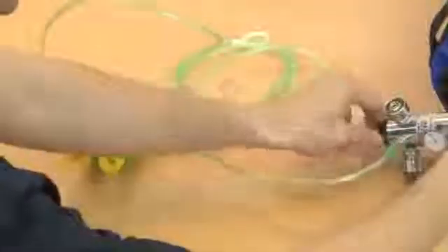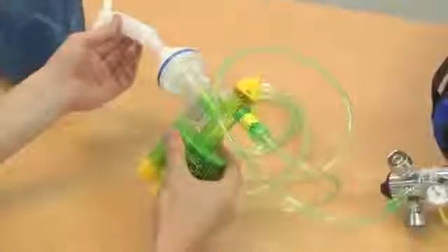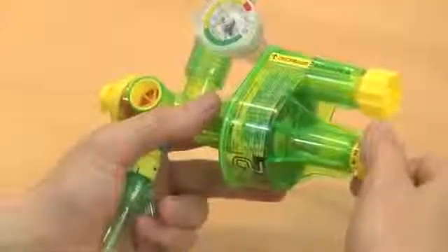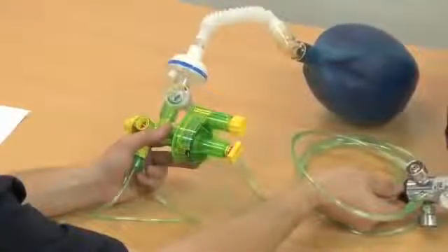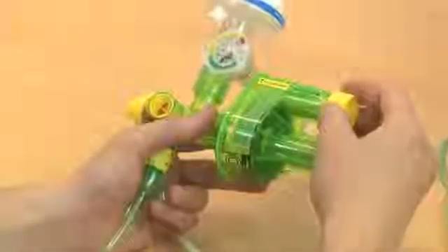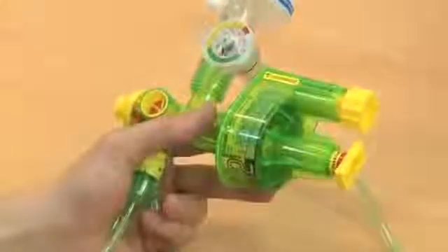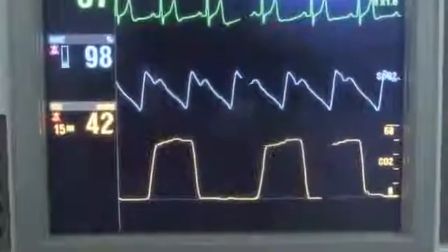Cut the cable tie and assemble the device. Connect to oxygen running at 15 litres per minute. Connect to the patient circuit. Adjust FiO2 by turning the Venturi sleeve. Adjust peak inspiratory pressure by turning the pressure control knob. Adjust respiratory rate by changing the oxygen flow rate. Finally, adjust the IE ratio by turning the rate control knob on the modulator to give the desired IE ratio. Continue to monitor ventilation using the pressure manometer, the end tidal CO2 waveform, and the respiratory rate on the patient monitor.